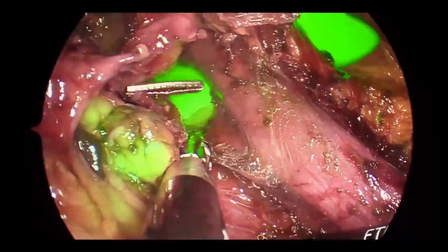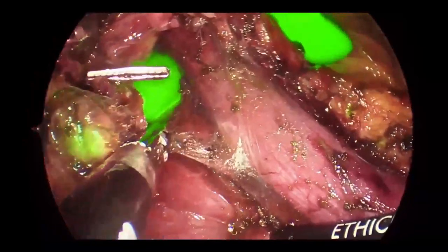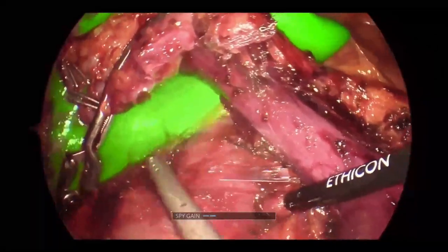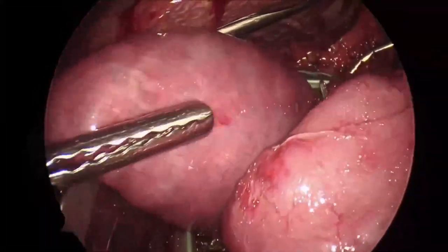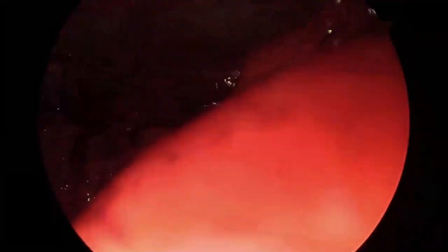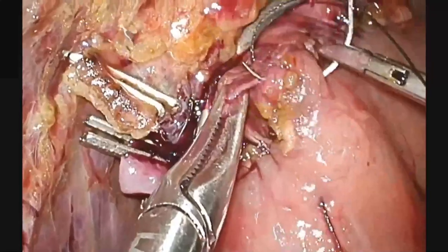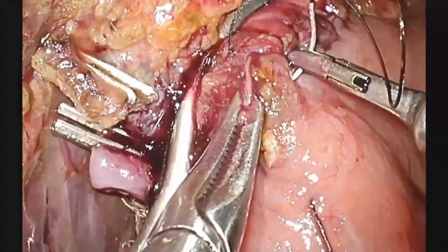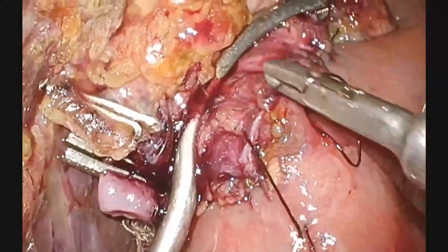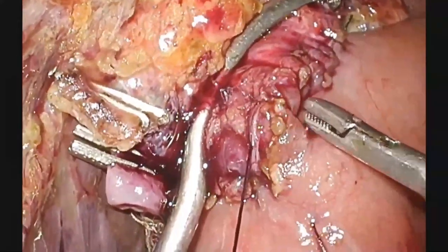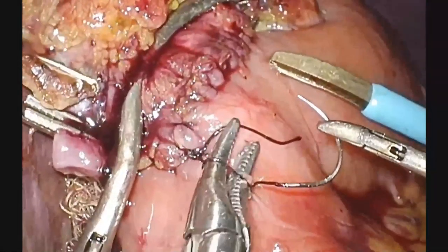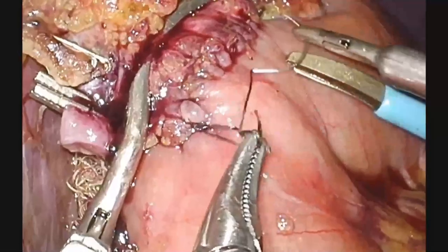Indocyanine green lights up the liver. The superior mesenteric–portal vein trunk and the cava are evident. The specimen is placed in an endoscopic retrieval bag and removed from the abdominal cavity through an enlarged port site. The reconstruction is now performed, starting with the hepaticojejunostomy. A running suture in two layers is performed in the usual fashion. Here the anastomosis is completed. The bulldog is removed.